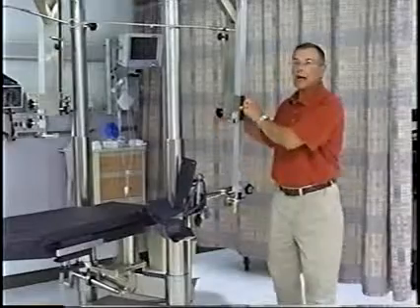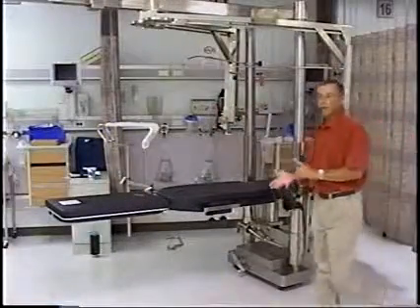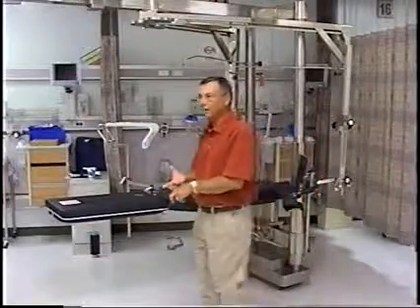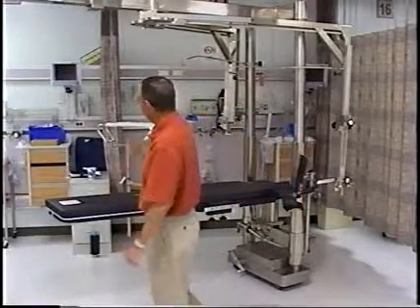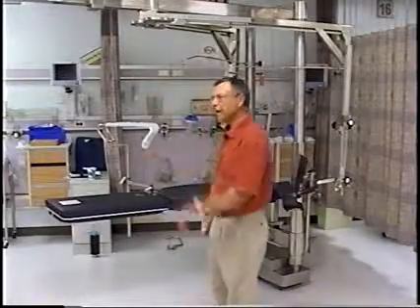Our new table does not have this at all. Not at all. It's a powered table, 500-pound articulation. Comes up to about that high off the floor. So, and you'll see that later.